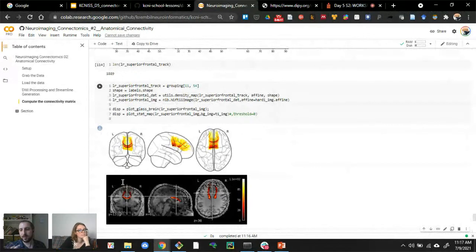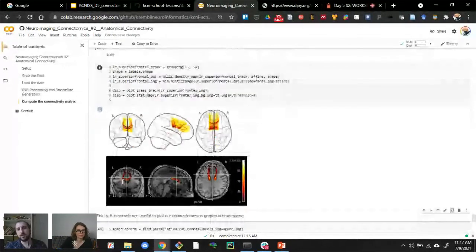If you have some information that's in the three-dimensional brain space, such as a lesion, for example, or maybe you're doing the kind of thing we do in my group, brain stimulation, or maybe you have some gene expression profiles, or something that you have in an image, and you want to associate it to a connection in the brain, then you have to go through the three-dimensional structure of the fibers, right?